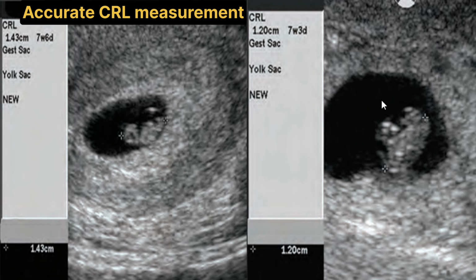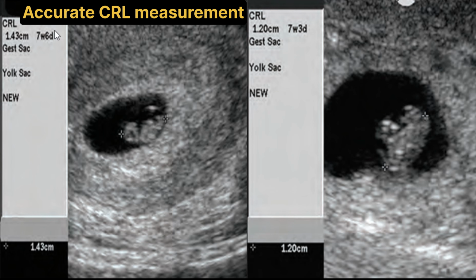Now we are going to discuss the correct measurement of the crown rump length. Here we can see a longitudinal transvaginal image of the embryo, and it shows the incorrect measurement of the CRL. This is due to the yolk sac being taken as the head of the fetus, and the caliper is placed including the yolk sac as the head of the fetus. It gives a false measurement of about 1.43 centimeter, corresponding to 7 weeks and 6 days.